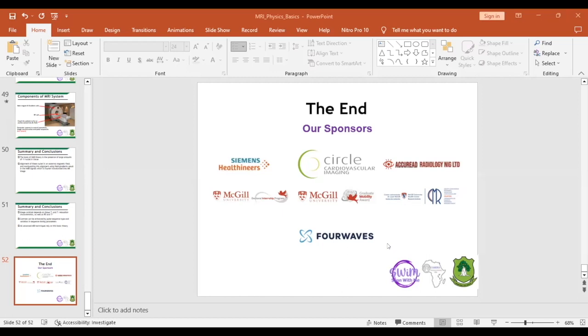And then one other thing you need to check is to look through your scanner to be very sure you are not selecting a number that is below average or above average. What I mean is, I know in Africa, what we sometimes do is select something like 200, 250 for the TI Scout, and then we assume that it is the darkest myocardium. But when I did a little research on this recently, I realized that I was selecting a very wrong TI Scout number and using it to run my short axis scan.